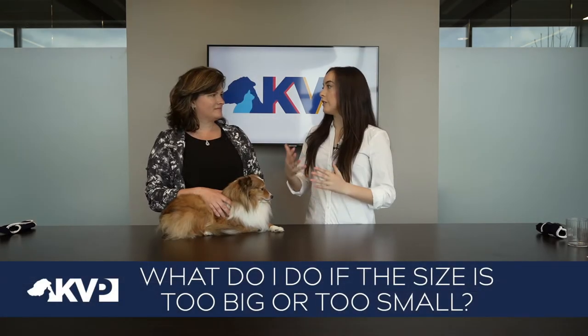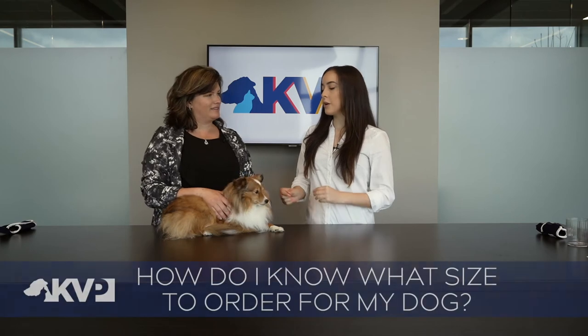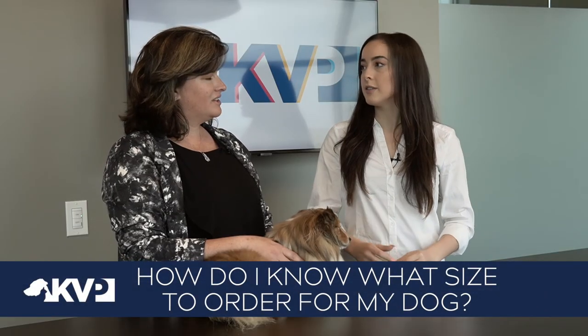What do I do if I order too big or too small a size? If you end up with a size that doesn't fit your patient completely, get a hold of one of our team members at KVP Ortho and we'll help you switch it out for the correct one. When selecting the correct size, after you get your measurements of the carpal joint and the length of the leg, if you are between sizes — like between a small and a medium — go with the smaller size so you still have the support but not too big a brace.